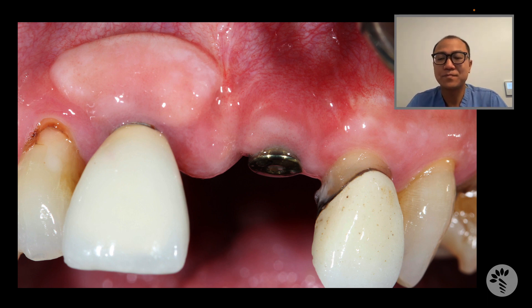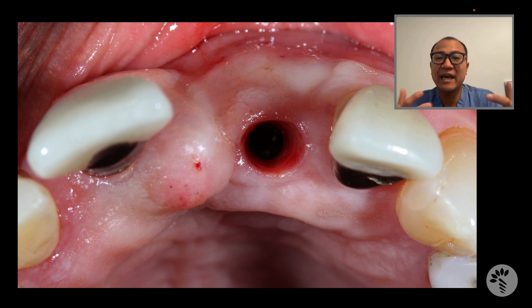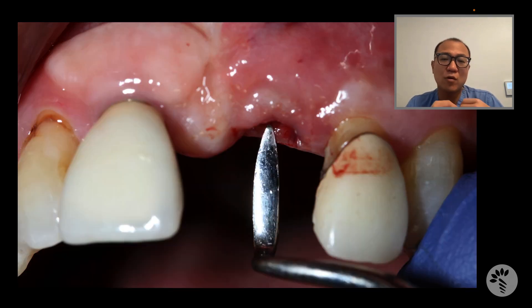This is when the minimally invasive connective tissue graft technique comes into play, and I'll show you how to do that. First, I remove the healing abutment and you can see the emergence of the soft tissue. I then use a sharp instrument — not as sharp as a 15 blade or similar — and go in to create a pocket of the gum within the emergence.